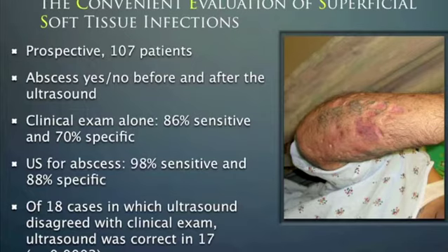So if you look at this picture here, this guy came in and he has many scars on his arm consistent with the signs of chronic IV drug use. The patient himself thought he had an abscess in this area that is red and indurated here. Now, prior to using ultrasound, one would have likely explored the area in question surgically, however, unnecessarily, since this patient only had the signs of cellulitis demonstrated on ultrasound and there's no actual abscess.